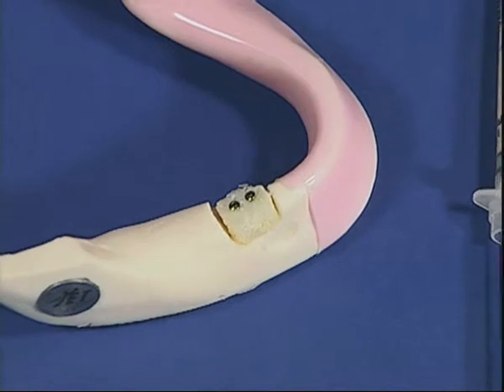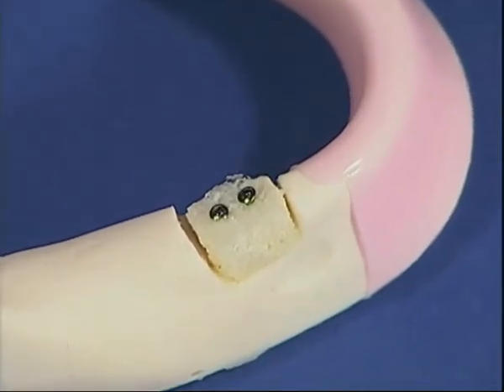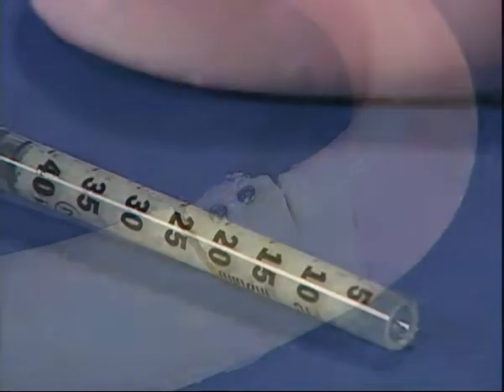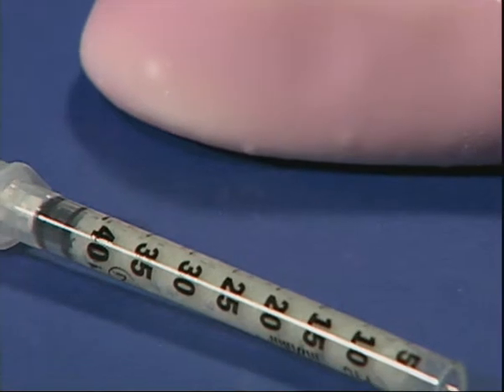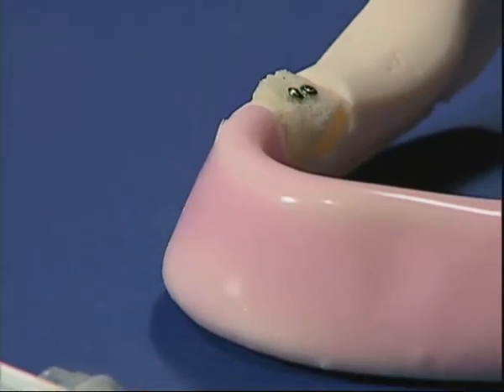When the bone is forming, it undergoes mineralization, which is the same phenomenon that occurs when a fractured bone undergoes repairing. Initially, the tissue created is osteoid and contains this material, which will be reabsorbed in a second phase.